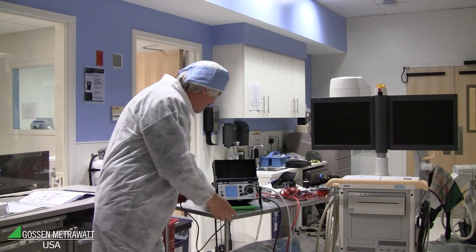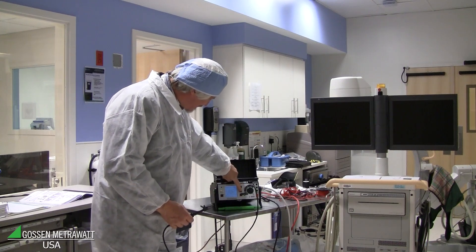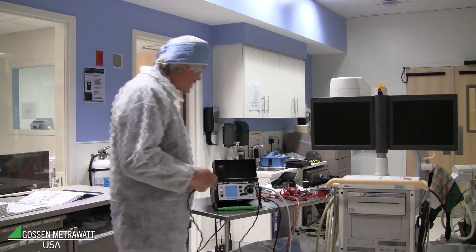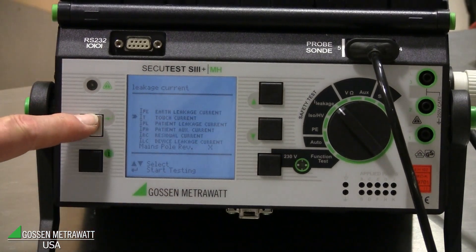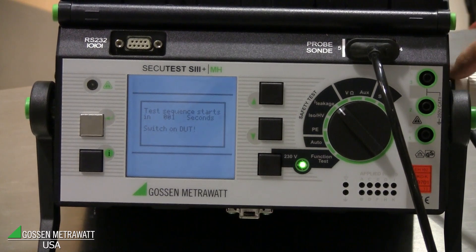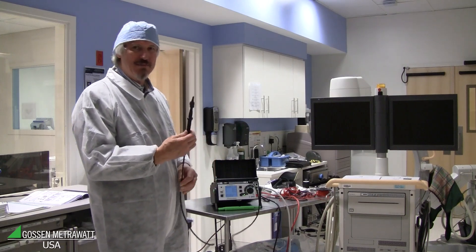Then we have to start the measurement. It's a leakage current and here is a touch current. The tester is looking if there is some equipment connected, and we make some tests before starting. Switch on the power of the equipment and then you will see the RMS value of the touch current. To look at AC and DC, just push the button down and you see the AC and DC value of the equipment. It's zero because I didn't connect the probe.